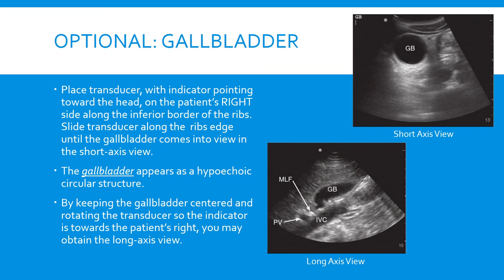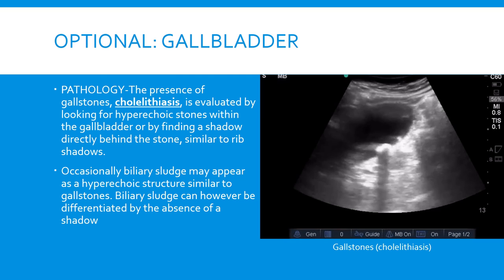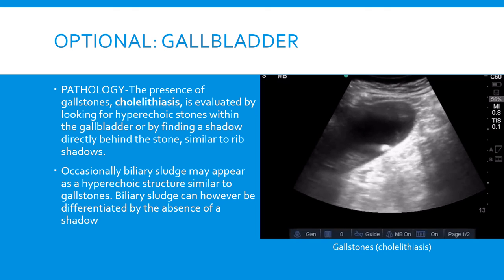The last structure we're going to talk about is the gallbladder. To find it, place the transducer on the patient's right side along the inferior border of the ribs and slide it along the edge until the gallbladder comes into view. With the indicator pointing towards the patient's head we find the gallbladder in the short axis view, where it appears as a circular hypoechoic structure. We can then rotate the probe 90 degrees with the indicator pointing towards the patient's right side to get the long axis view. Gallstones appear as hyperechoic structures within the gallbladder with a shadow behind them, similar to a rib shadow. Biliary sludge may also appear hyperechoic but can be differentiated from a gallstone because it will lack that posterior shadow.